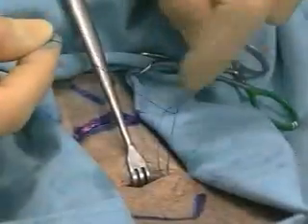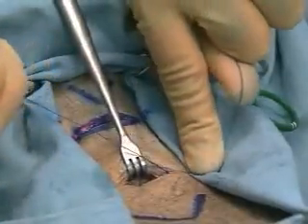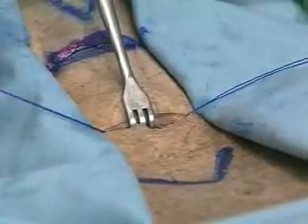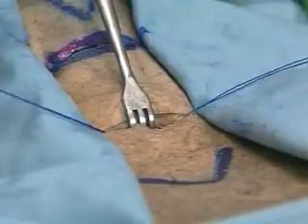The patient should be positioned supine with the neck in the neutral position. In trauma patients, care must be taken to protect the spinal cord, as a cervical spine injury must be presumed until radiologic and clinical examination have excluded this diagnosis.